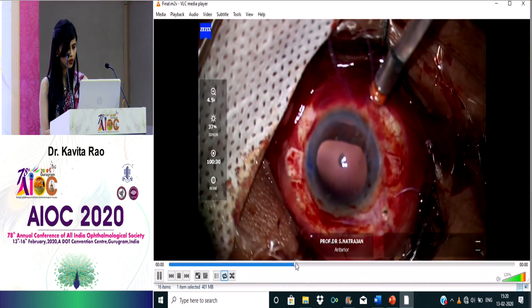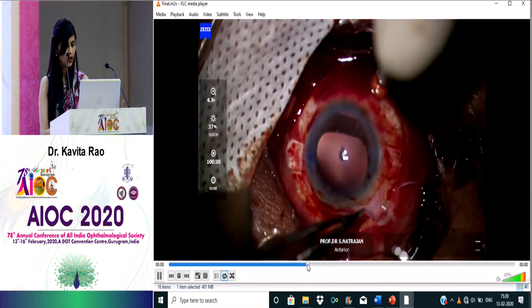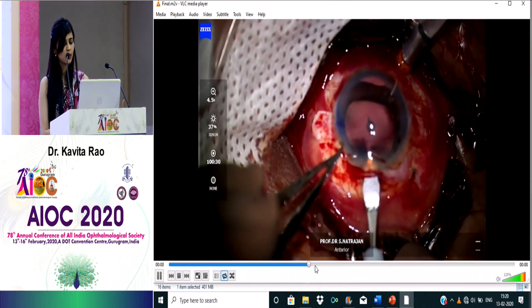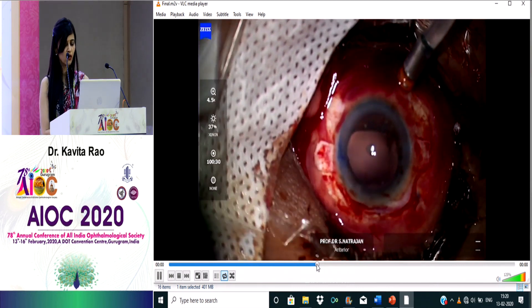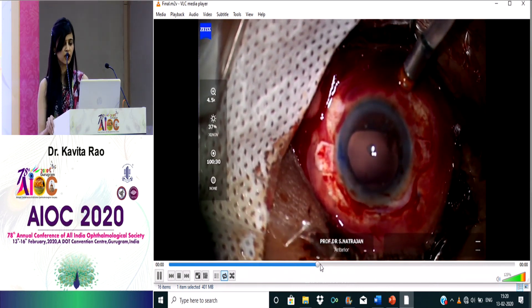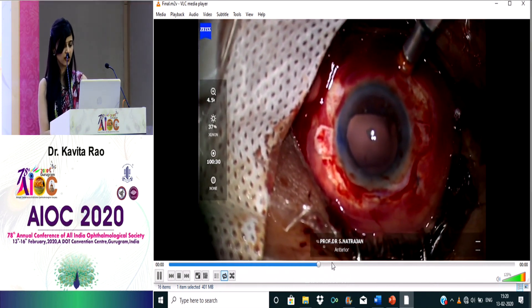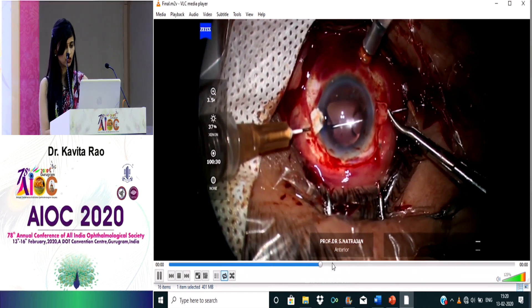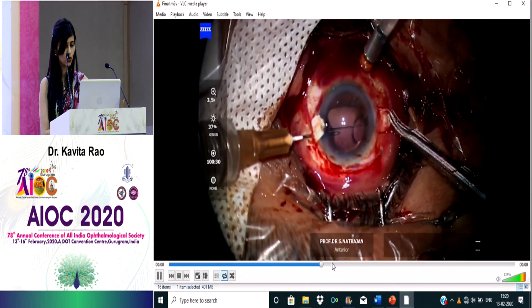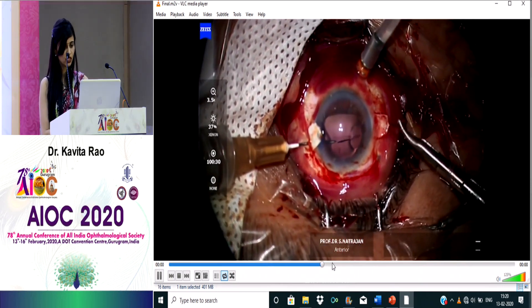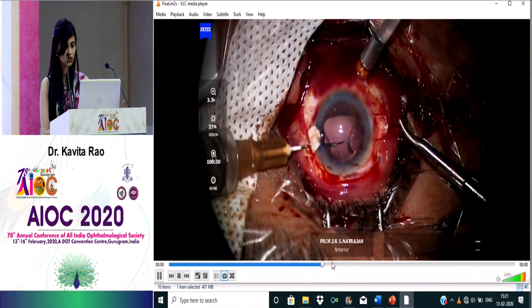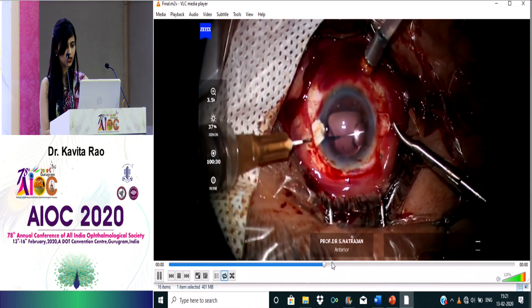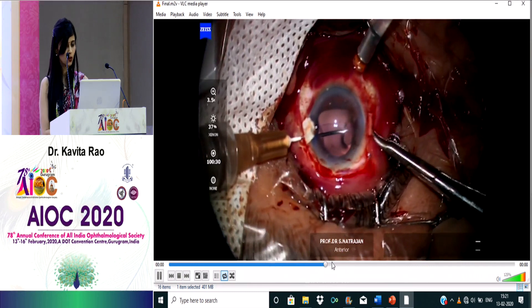Now that the nucleus is done, I've taken over and closed the sclerotomy port. I performed the railroading technique to put in an SFIOL. I passed two prolene sutures — one is already in the eye and this is the second — which are then brought anteriorly from the center.